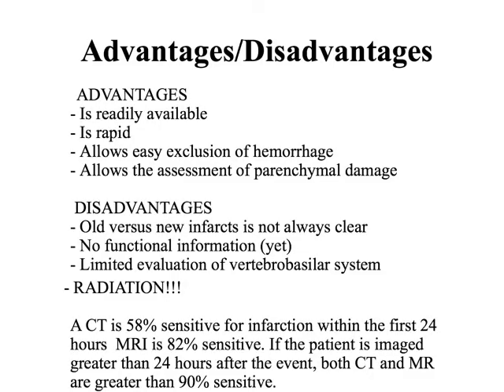So in terms of advantages and disadvantages of CT for evaluating for stroke and for trauma, a lot of places have it. It's readily available. It's very, very quick. As we mentioned earlier, if we're dealing with an institution that has a stroke protocol, generally we need to get the patient's exam performed and read within 30 minutes of when they call that stroke protocol. So it's very, very rapid.